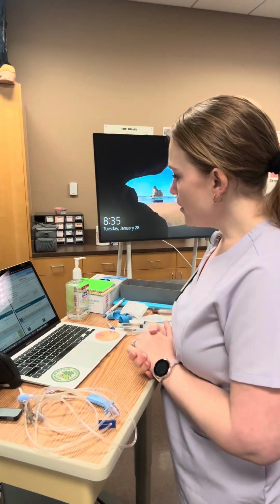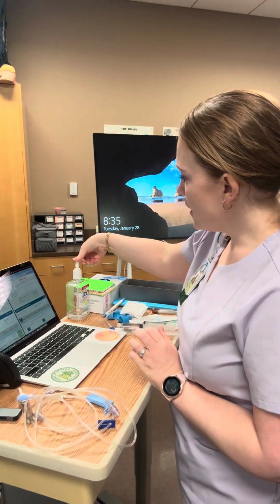Hello, we are going to do the IV start and hanging the sodium chloride skills checkoff. And so let's get it started. First thing we are going to do is begin with hand hygiene.